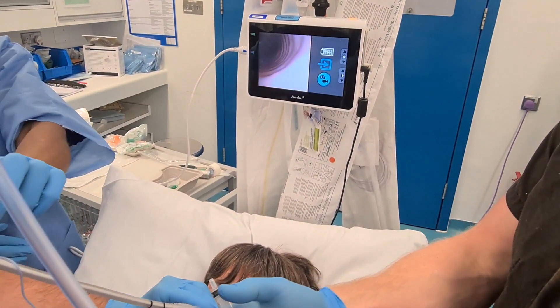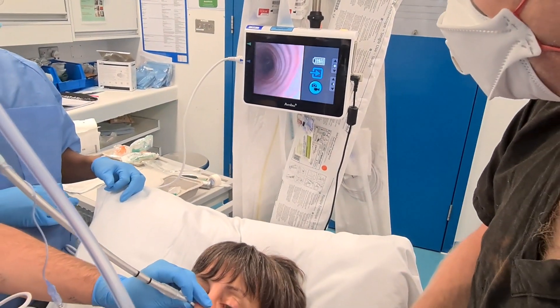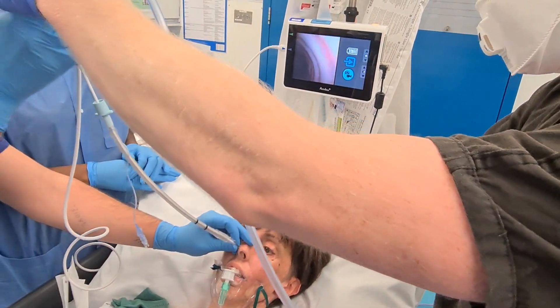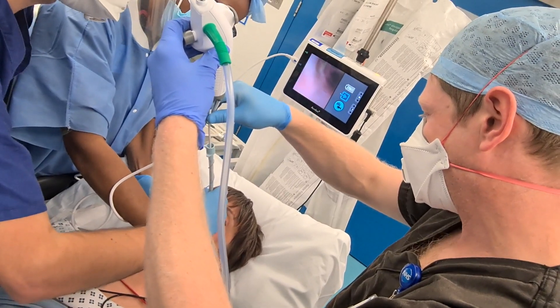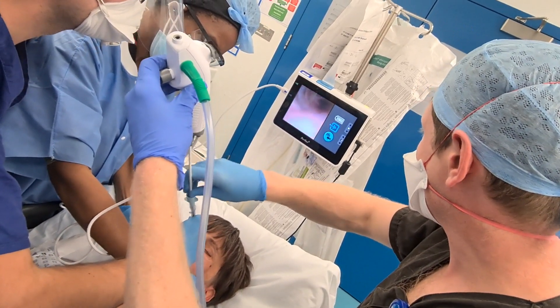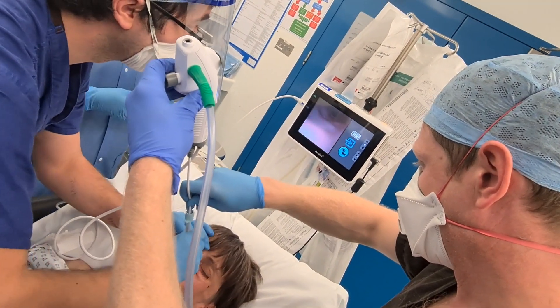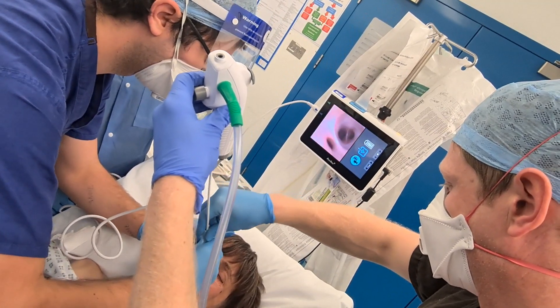I'm going to go a little bit closer. Let me take it and pass the tube. That's it — well done, you're doing great. You're going to be going to sleep very soon. You did really, really well. You're doing really well. Keep going for us. You're doing really, really well.